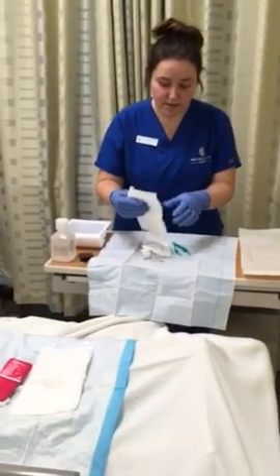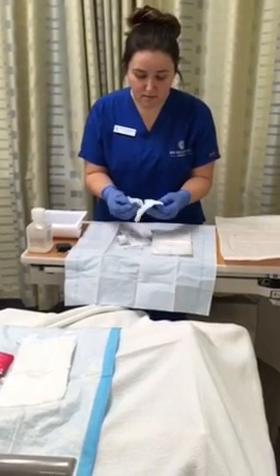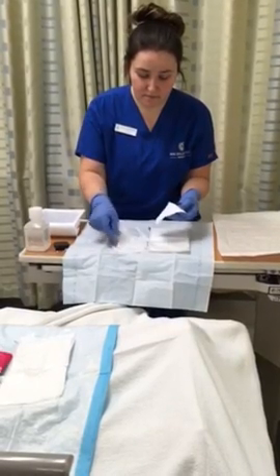I can go ahead and arrange my sterile field, making sure that I maintain a 1-inch border.